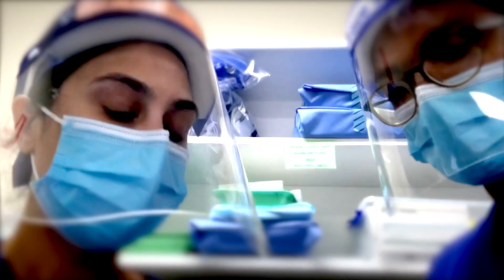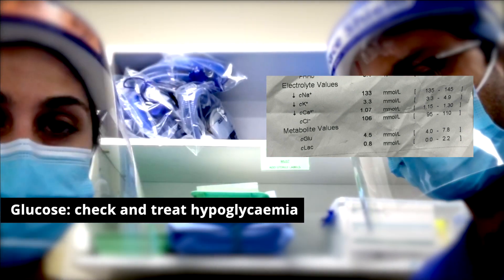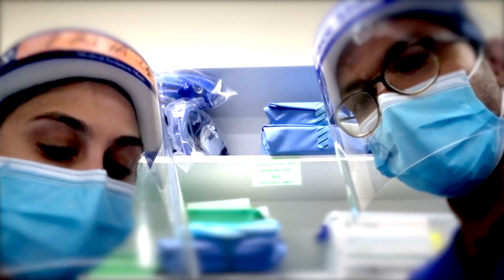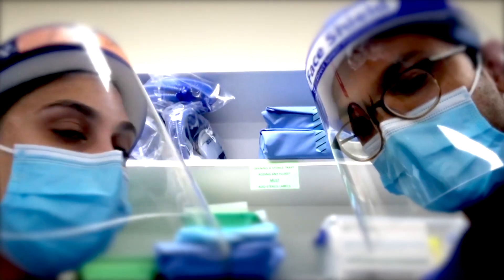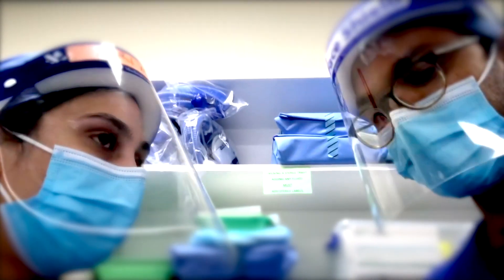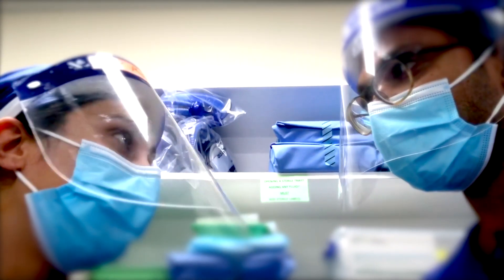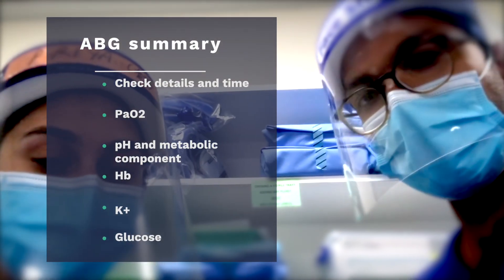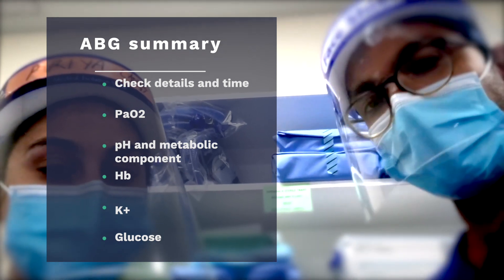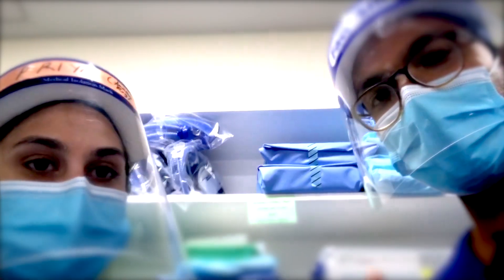Finally, check glucose — significant hypoglycemia must not be ignored, and significant hyperglycemia is also important. We're not aiming for tight glucose control; a range of 4 to 10 is fine. If glucose is low — say 1 or 2 — I'd treat with 50% or 25% dextrose, then run a 5 or 10% dextrose infusion and monitor closely via arterial line. To summarize: identify the patient and time, check pH, rule out metabolic acidosis, confirm safe O2, then check hemoglobin, potassium, and glucose.